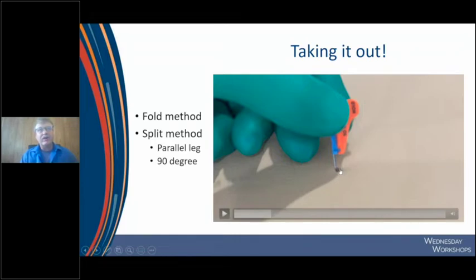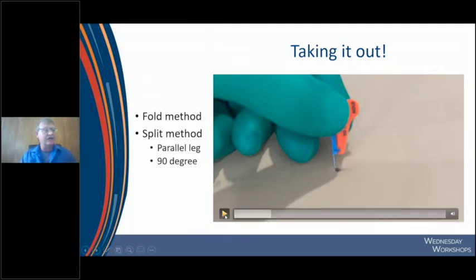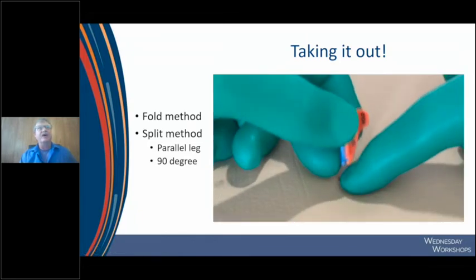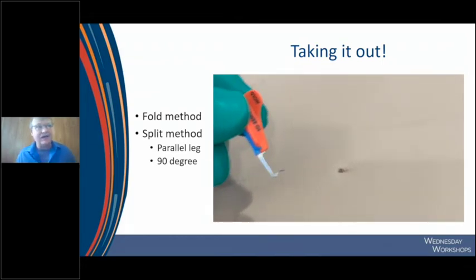You're going to take your finger, place it right over that insertion site or the exit site where the foot is, and push gently but firmly right into the insertion site, and then just like a ninja, you're going to pluck this thing out, lickety split. I'm going to show this to you now. Here we go. Over the foot and right out, just like that. That is quicker than 3 shakes of a lamb's tail, folks. I'm telling you, if you have any issues with any of the other methods, this is the way you are guaranteed to remove it without any problem whatsoever.